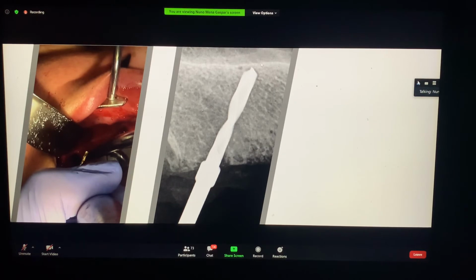Nhưng mà đối với implant Enrich, many times you don't need it. Ví dụ là khoan hai xương vỏ, nhưng mà đối với implant Enrich thì sẽ không có cần phải dùng điều này, bởi vì thread của implant Enrich rất là cắt. Because even in soft bone like this, you will have good torque.